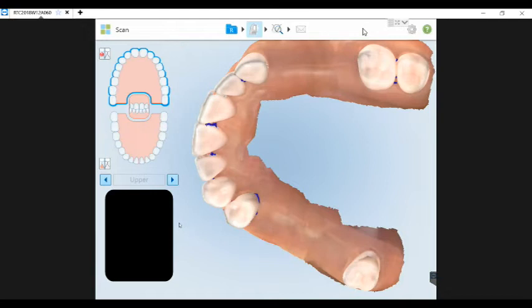Again, if it's the maxillary arch, I think you have much greater chances of success versus a mandibular arch that has a lot of bone resorption. This is really the time, in my opinion, to make use of four-handed dentistry. In many practices, it's the assistant that's doing a lot of the scanning, and in most cases that works out wonderfully. It can be really hard to scan a fully edentulous patient and manage the lips and tongue and scan at the same time.